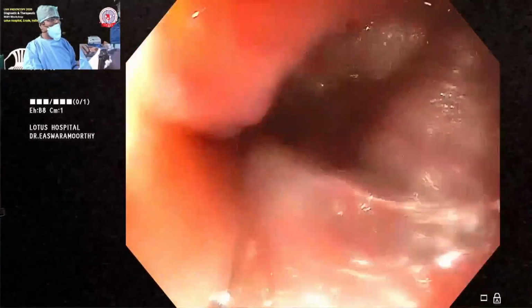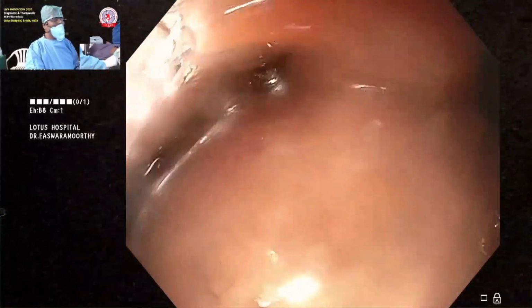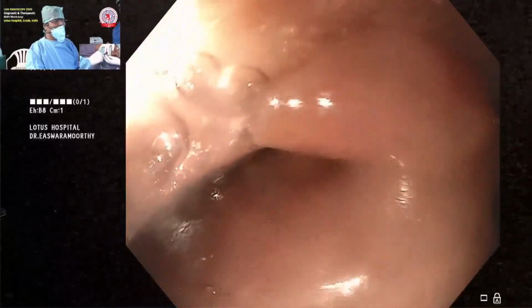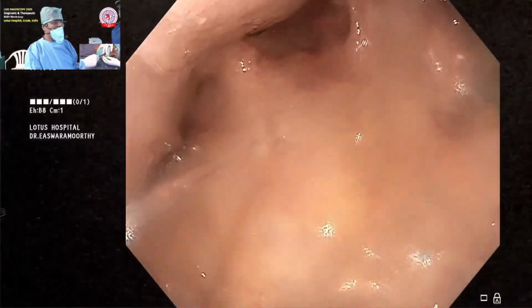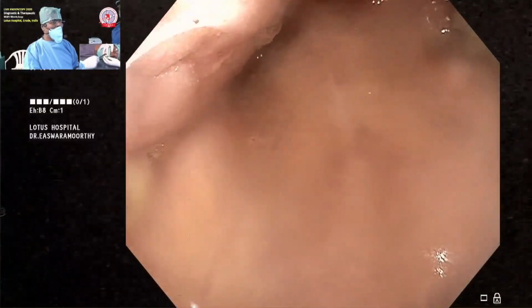Then you aspirate, and the uvula is seen like a polyp. Don't remove it. It is just the uvula at 6 o'clock position. And you haven't seen the teeth. That is the way you should do. Keep it at center. Don't see the dental examination come out. That's all over. Thank you.